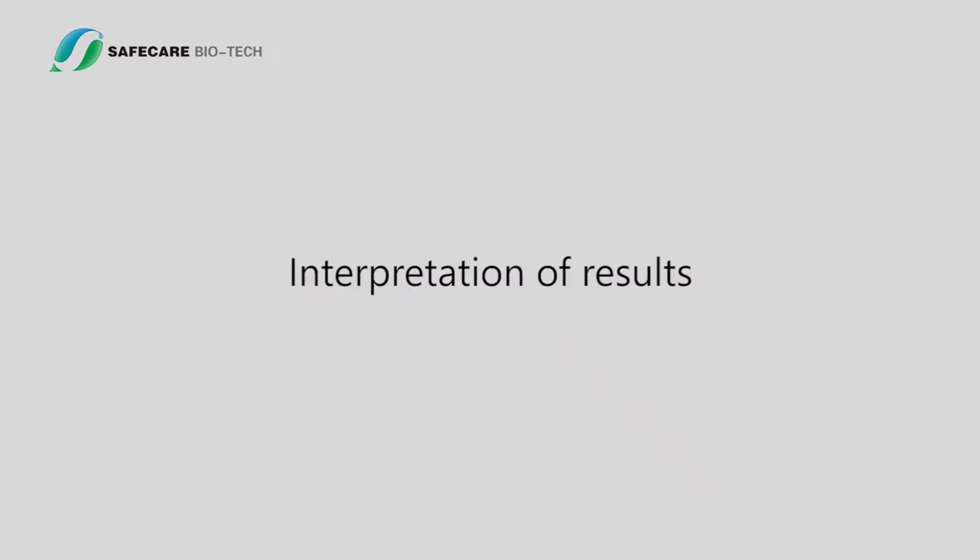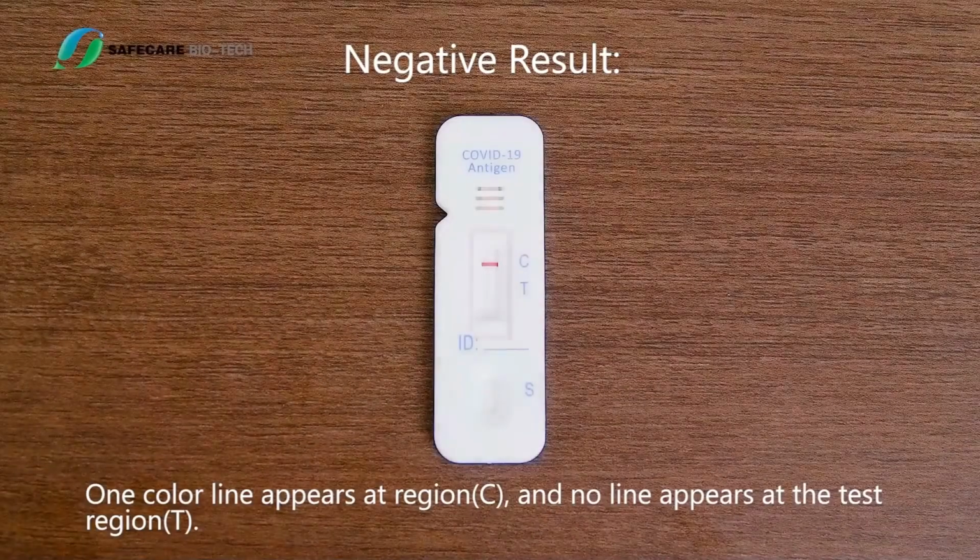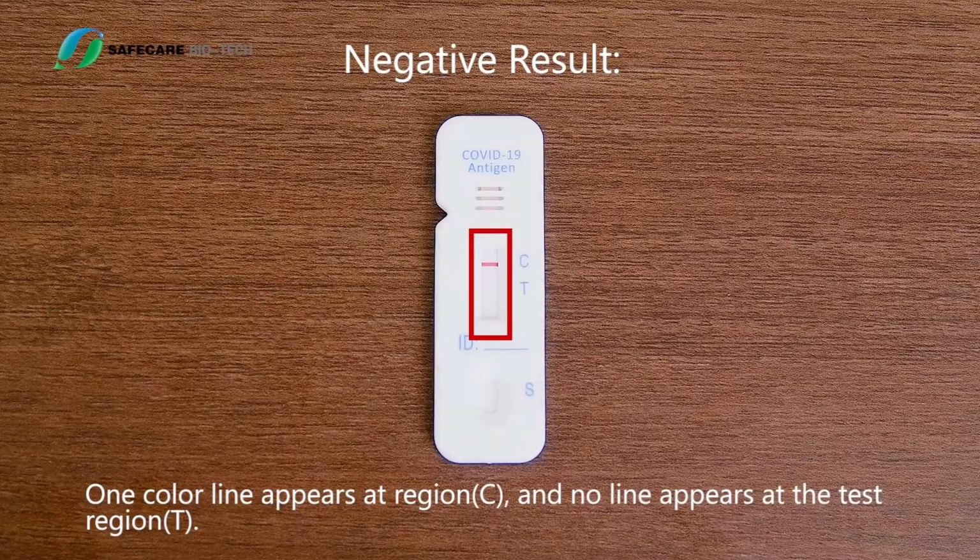Interpretation of results. Positive result. Two lines appear. One colored line appears at the control region C, and the other line appears at the test region T. Negative result. One colored line appears at region C and no line appears at the test region T.